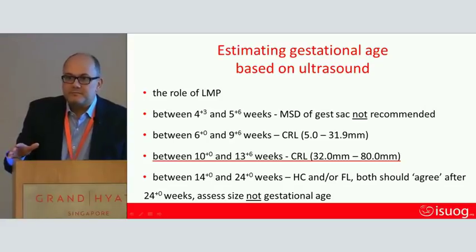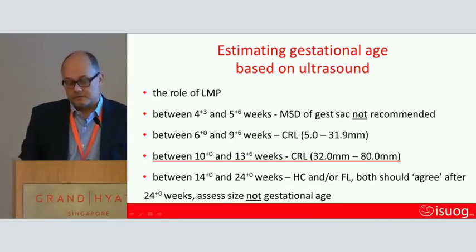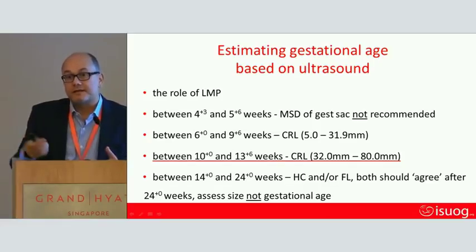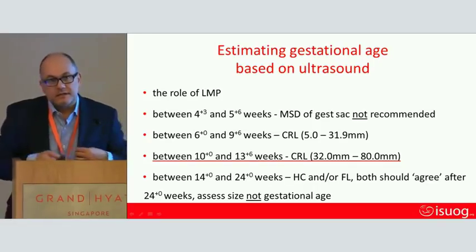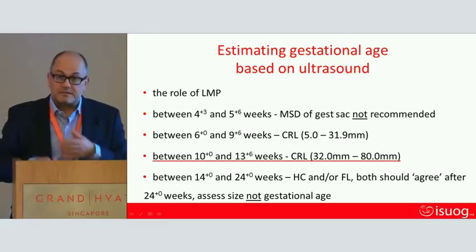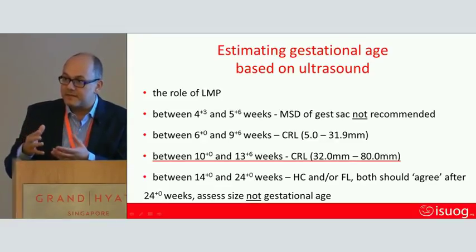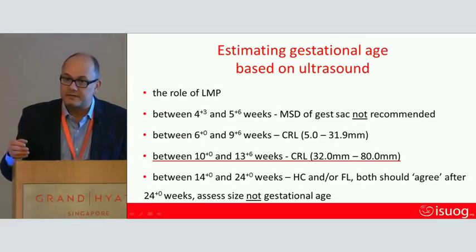So many women will not recall when their last menstrual period was accurately, or they may not have regular cycles. And in particular, in those circumstances, we can use ultrasound to measure the size of the baby, and by measuring the size of the baby, estimating the gestational age.